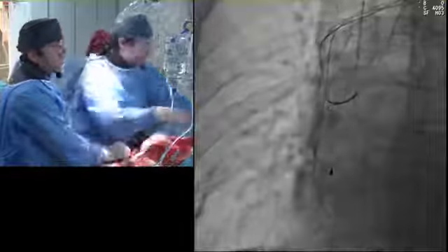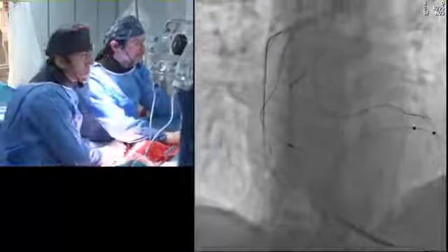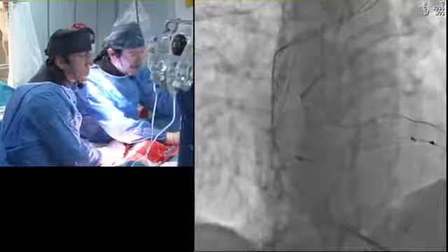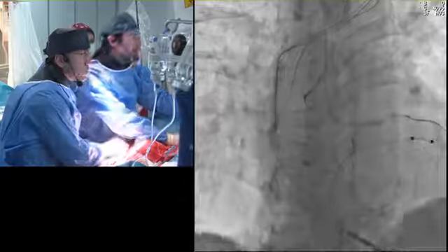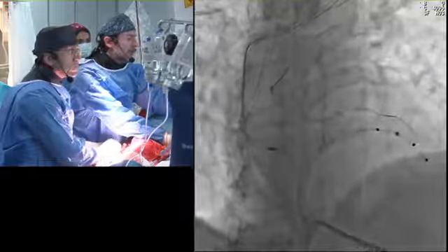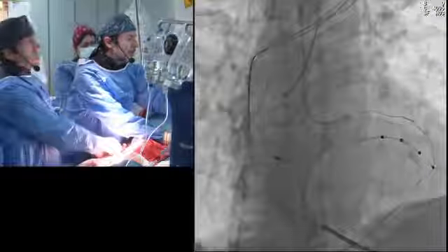So, okay. Sometimes it will take us 30 to 45 minutes. Right. You are almost 98%. So I don't want to make it that long. It should not take you more than 10 minutes. The problem is just to change the location. The RG3 is not floating freely, you know. Not going through. So probably the brachiocephalic region would be okay.